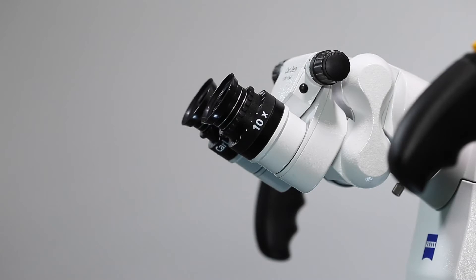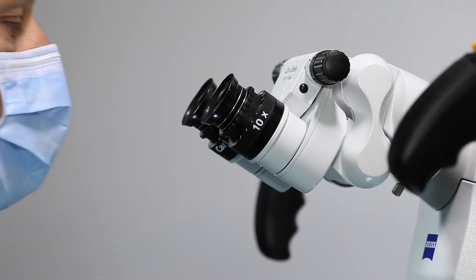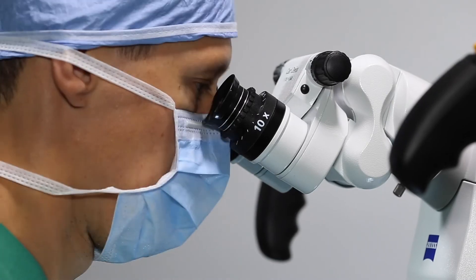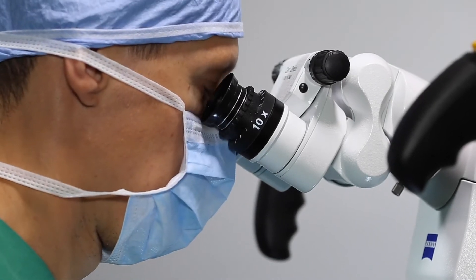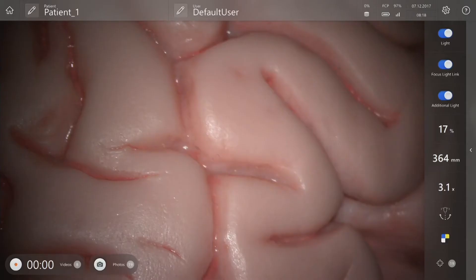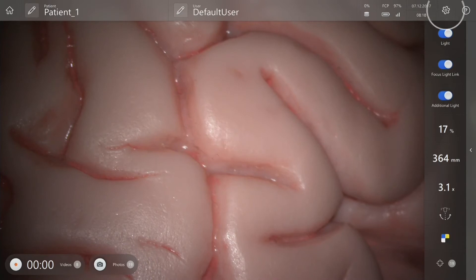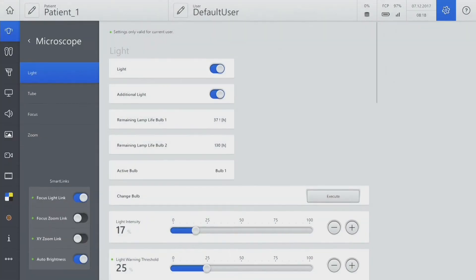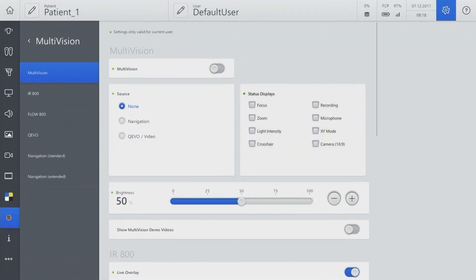Zeiss Kivo view can also be visualized in the oculars using Multivision. Ensure that Multivision is configured for this. Go to Settings, then go to Multivision and make sure that it is switched on.